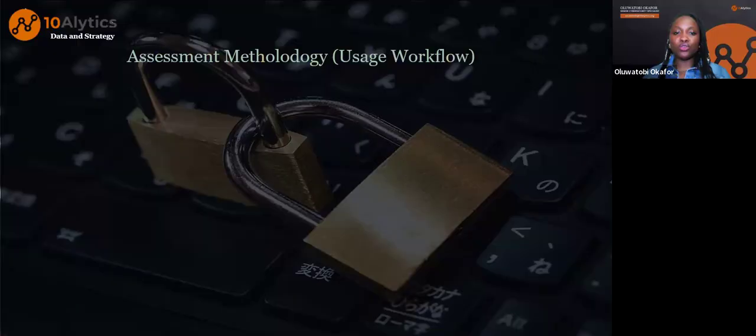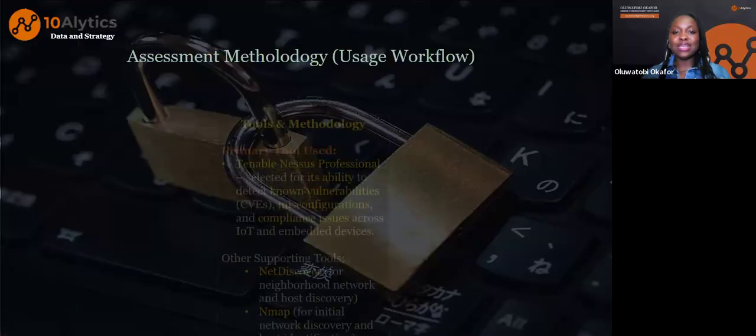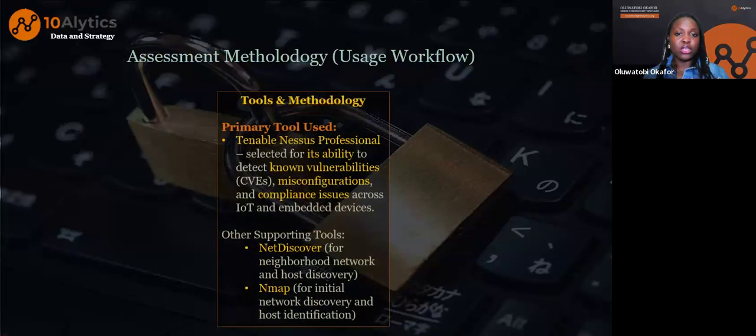So we are going to be using our favorite tool, Nessus, which is basically selected because of its ability to detect known vulnerabilities, misconfigurations, and compliance issues across IoT and embedded devices. Now, this is to answer, I believe that was Josie's question, where they asked if Nessus is a scanning tool that can check for vulnerability.